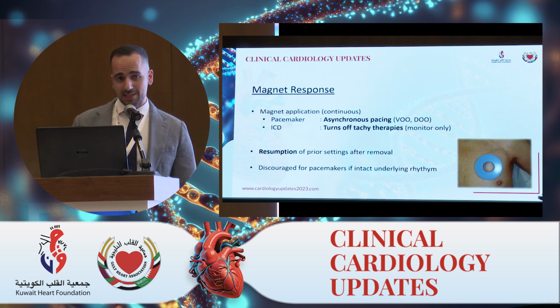In patients who have ICDs and are dependent on pacing, putting on a magnet will not change the pacing therapy, and that's important to keep in mind if this patient is at risk of electromagnetic interference, because those will need reprogramming.